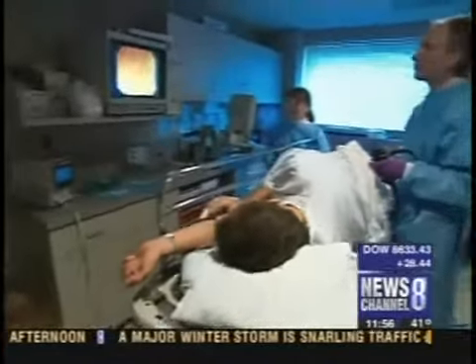It's an excellent procedure. What it replaces is being put to sleep and losing a day of work, by instead lying on a CT scanner, which is a technique many people are already familiar with, and then having 2 scans, one generally on your stomach, one on your back. The entire procedure takes about 15 minutes. There's no sedation. It's completely safe and risk-free.